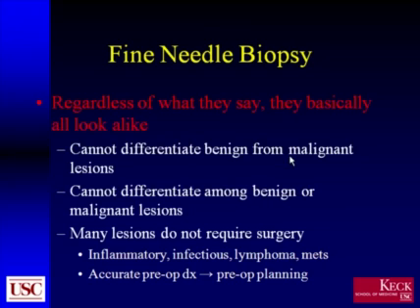I think if you look at the images that we've shown, you can see why I believe very strongly that fine needle biopsy of these lesions is important. And regardless of what some of the papers will say, basically in our book they all tend to look alike. And I don't think you can differentiate benign from malignant, nor can you differentiate among the benign or malignant lesions on either side. And it's important to know what this is up front, because many of these lesions will not require surgery.